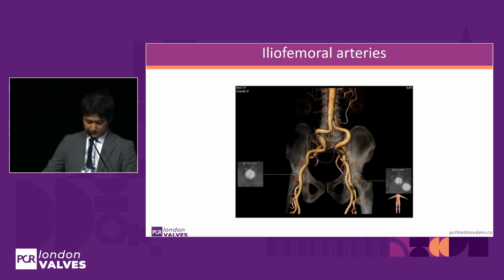Thank you so much, Yusuke, for your presentation. So maybe I would like to ask Simon for a short question. How would you treat this patient, taking into account the lifetime management? Yes, so I think this is a very important message, because for immediate success or results, every valve can do a good job. But we are looking at lifetime management. This is a relatively young patient and also has some coronary artery disease to start with. Then in the future, we need coronary access, and future TAV-in-TAV.